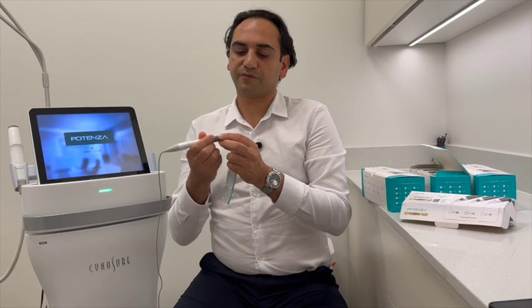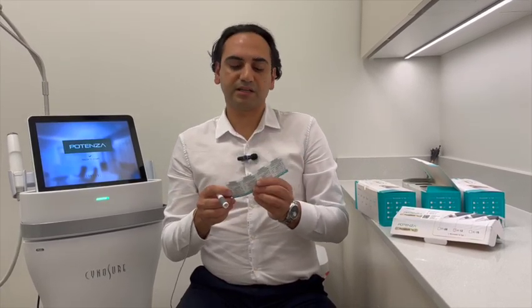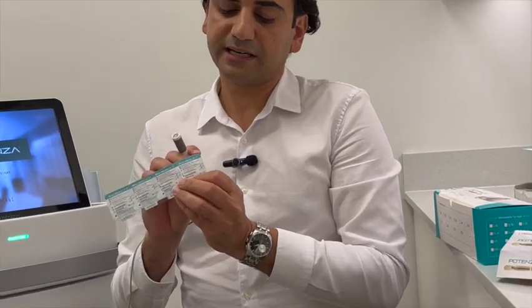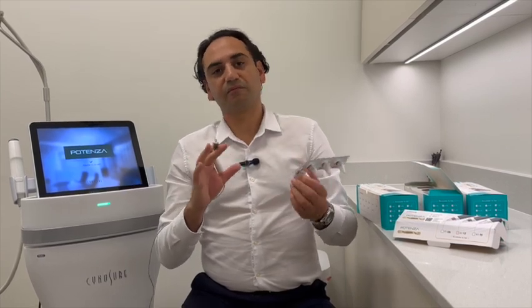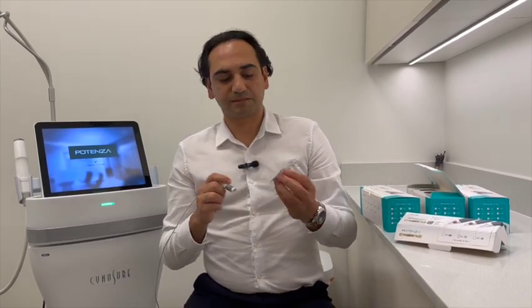The A-tip is mainly used for nodulocystic acne. For example, someone comes in with a zit before an event — they say they have a wedding coming up in a week and they have this zit. This is the best treatment for that. It may be a little more pricey, but it responds very fast. We deliver energy with this single needle tip directly to the nodulocystic acne, typically between three to five energy deliveries — about three to six pulses — and that helps the nodulocystic acne resolve in a very short period of time.